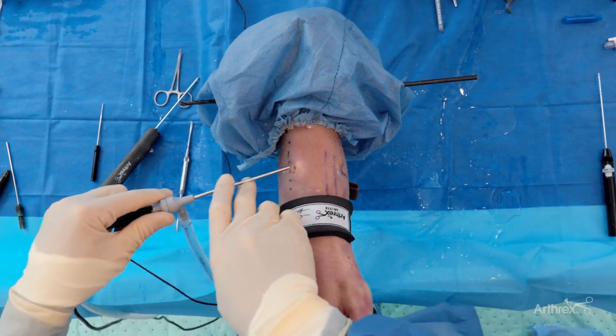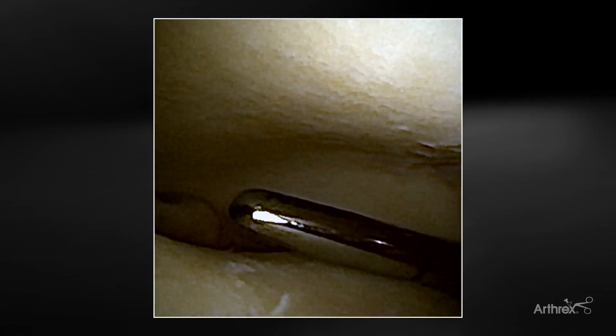Justin, you and I have had several conversations and we're working on projects together. So I've switched the portals. I usually like to have the flat part basically facing up towards the tibia or the patient's head — that gets me oriented on the camera so I know that I'm looking up at the tibia. It just helps me keep orientation within the joint. Switching portals here, coming around to the medial side. Getting our shaver in — still a little bit of synovitis that we can work on.